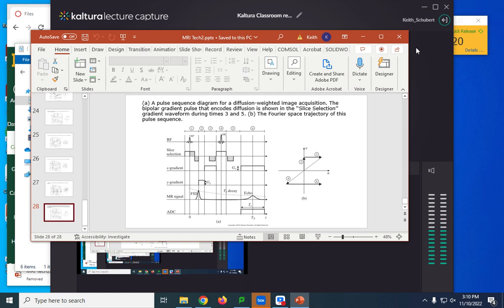The main reason being this adds one more level of panic on most people. We're shoving you in a big metal tube, and now we're giving you a breathing system that's gating you, and hooking you up to wires. Those wires have to be non-ferromagnetic so they can be used in there, and the electrical signal can still cause perturbation, so it becomes kind of an uglier thing.